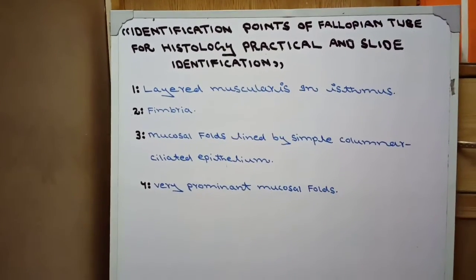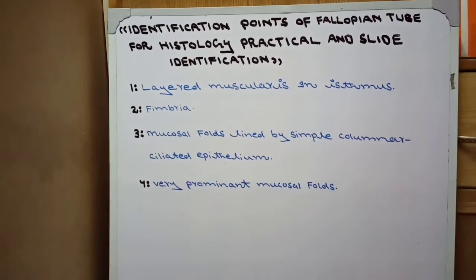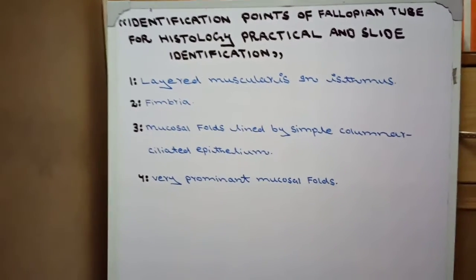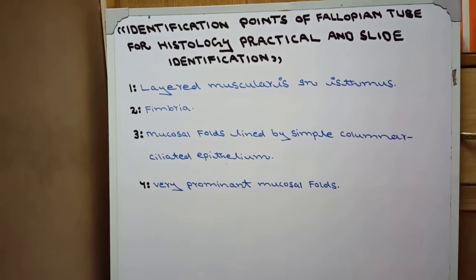I already uploaded the slide detailed video for identification of fallopian tube on my YouTube channel, and now this is identification points.